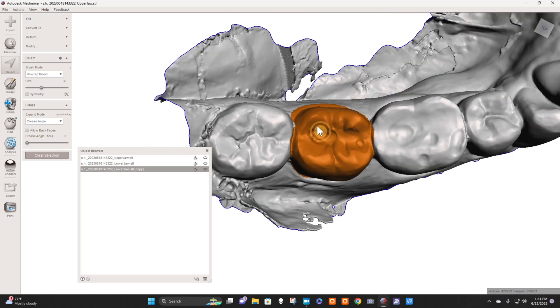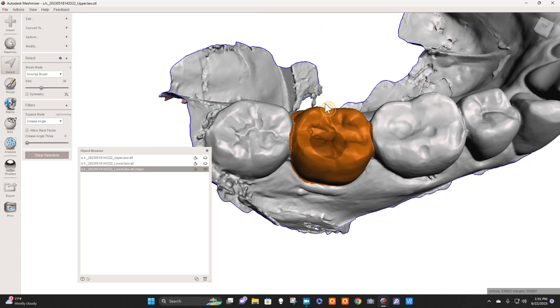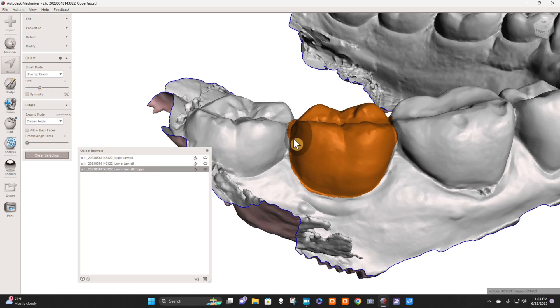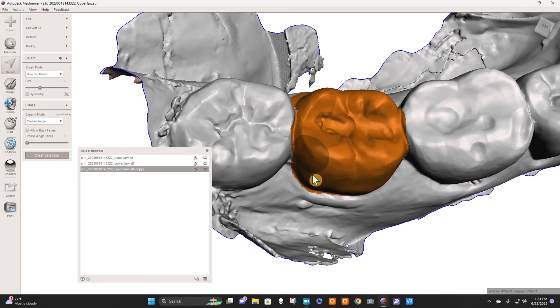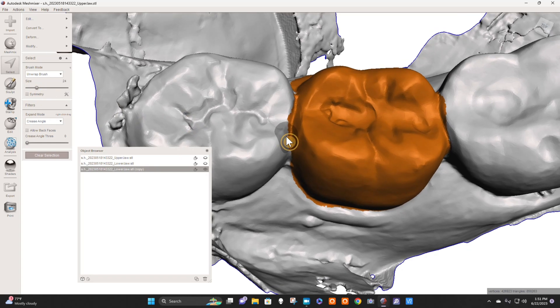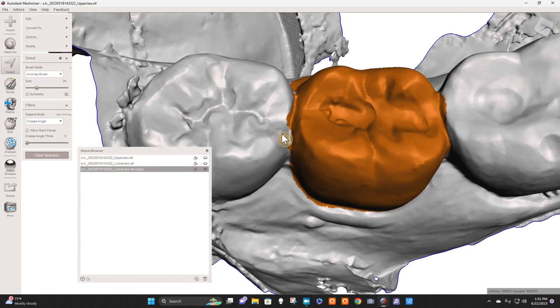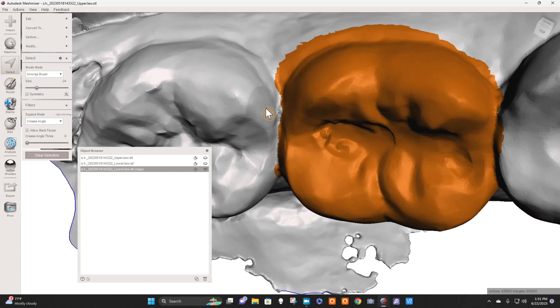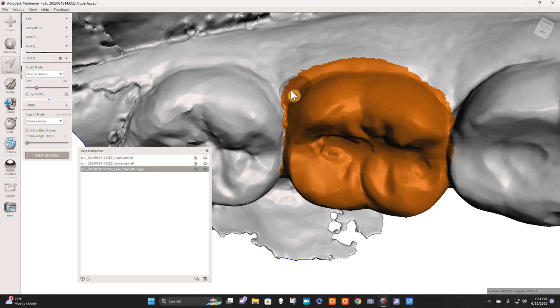You could also create face groups and alter the threshold of the face group and find the teeth that way. That's sometimes beneficial if you're doing multiple teeth. Just get right in here. Now what I'm going to do is try to get right at the CEJ.